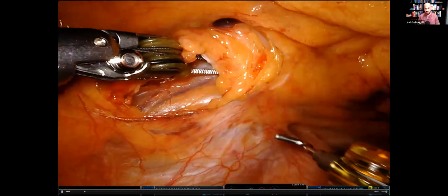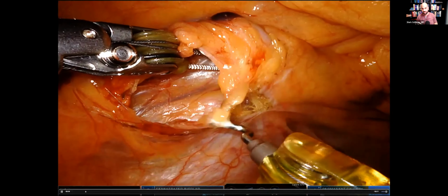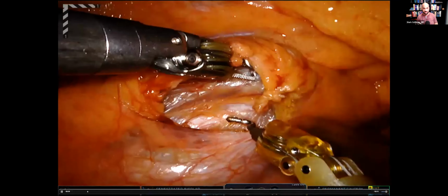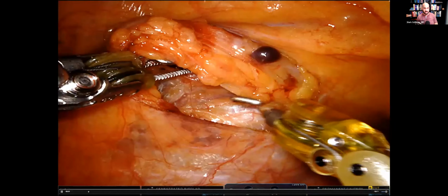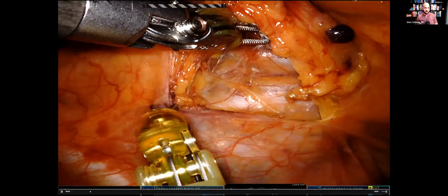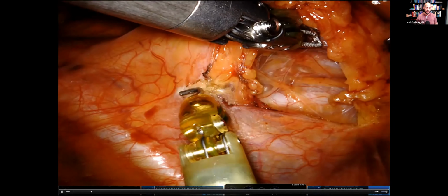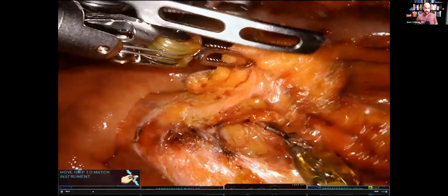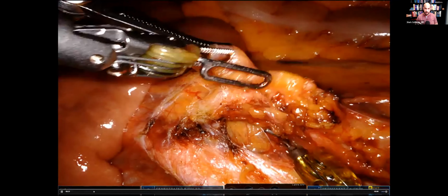It's an older video because I'm using hook cautery and not scissors. But you can see, obviously, it can be done with either instrument, no problem. Left hand, poke, spread, lift, pulling towards the head. Again, this is my infra-IMA approach. You can see, no matter the BMI of the patient, they're going to have this plane here. It's just a little scary to find in a larger patient.